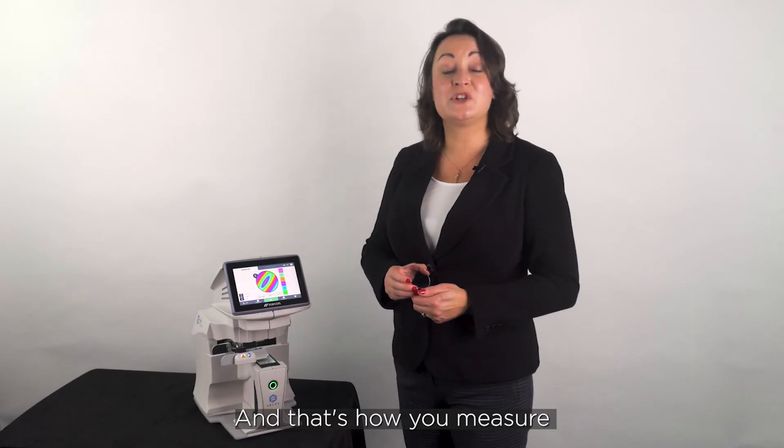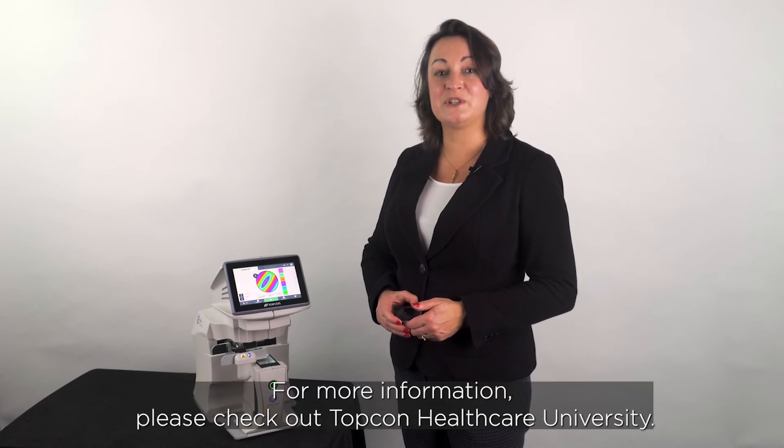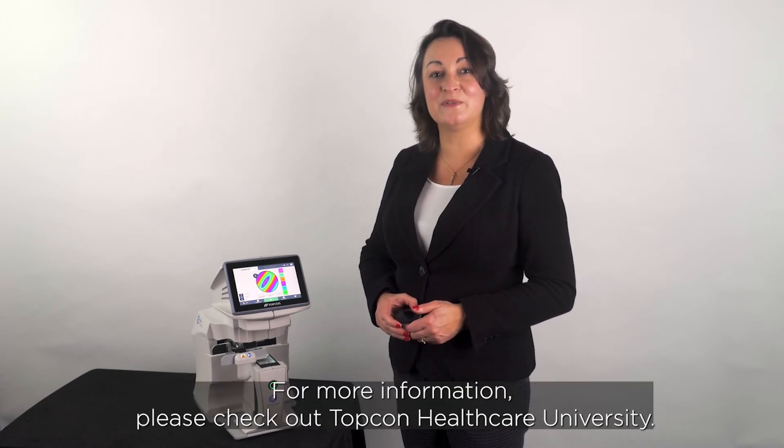And that's how you measure and mark up an uncut lens using the Topcon Solos. For more information please check out Topcon Healthcare University.